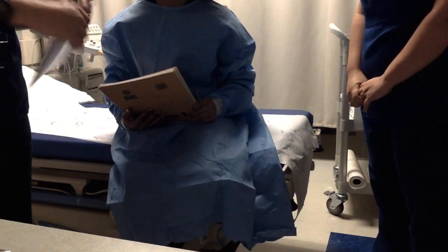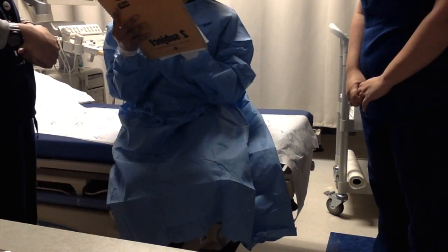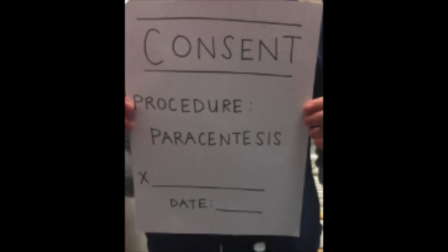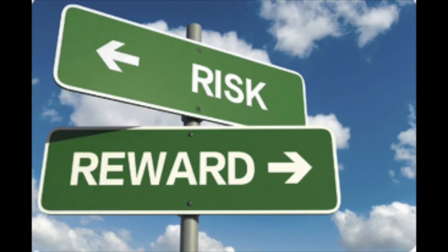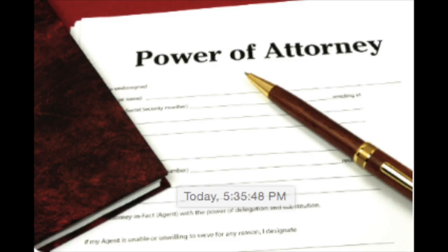Prior to starting the procedure, you must first obtain consent and lab values from the patient. The consent process is used to ensure that the patient is informed of the risks and benefits that occur with the procedure. The patient should also know how the procedure will be performed and what physician will be performing it. Another physician, sonographer, or nurse must witness the patient signing the consent form. If the patient cannot sign the consent for themselves, other legal forms must be filled out in order to continue.